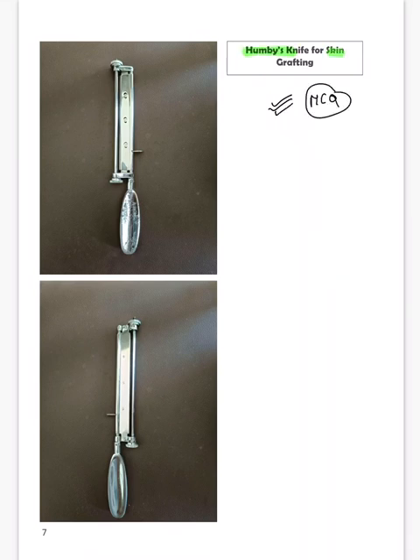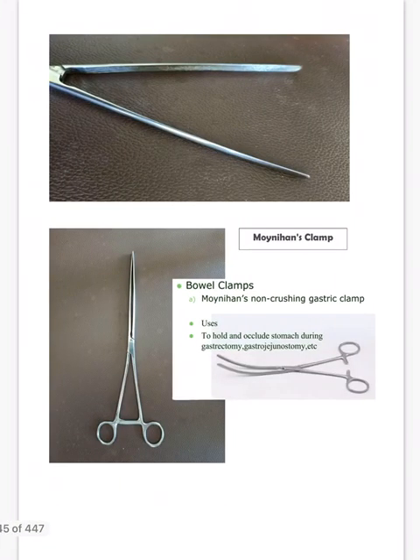So this is basically a Humby's knife, which is used for skin grafting in order to harvest the skin to graft at some other site. So in the next topic, when we will be talking about the trauma wala video, we'll also be discussing along with the topic of plastic surgery and the graft wala. There again we'll discuss this.